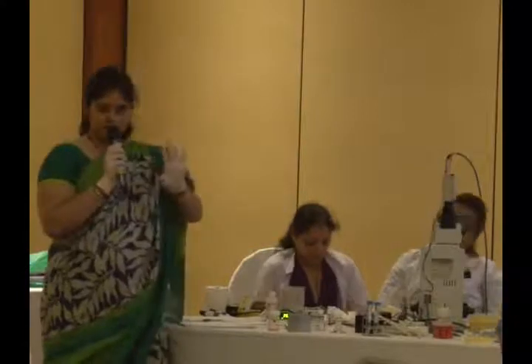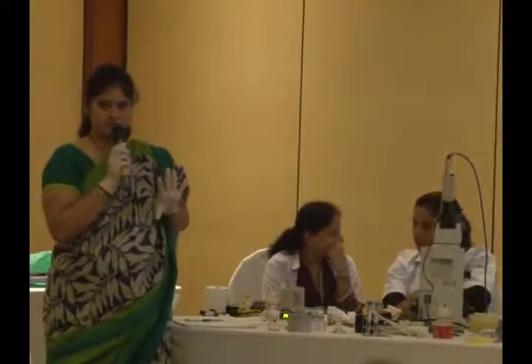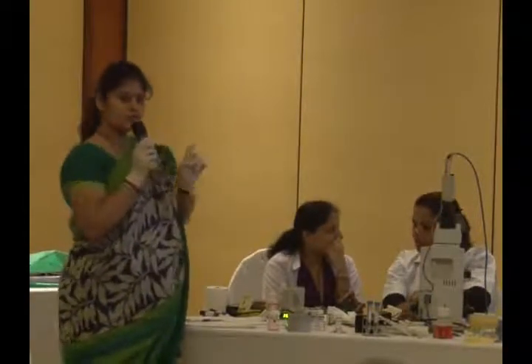See, you know the methods. Divide the sample, perform it in your lab, and whatever is giving you results, follow that. That is the best way to choose the method. Fine? So now this is about the first step of the swim up. Now we have 45 minutes. In that time, we will do the preparation for the density gradient. Right? So I am moving to the density gradient.